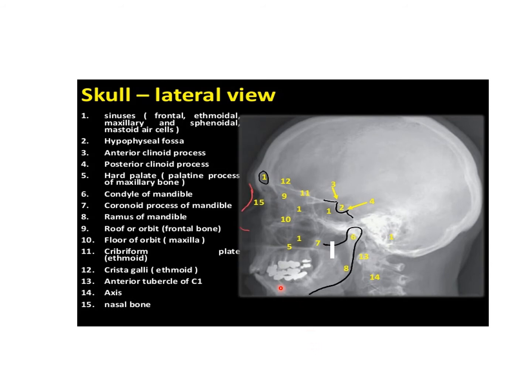This is the skull x-ray lateral view. Here you can see the paranasal sinuses: the frontal sinus, then the ethmoid sinus, then the maxillary sinus and the sphenoid sinus. Then here you can see the hypophysial fossa, the anterior clinoid process and the posterior clinoid process. In the hypophysial fossa you get the pituitary, and the inferior relation of the hypophysial fossa is the sphenoid sinus.